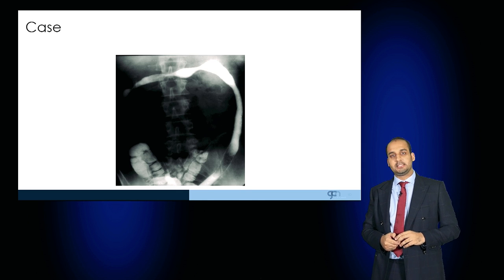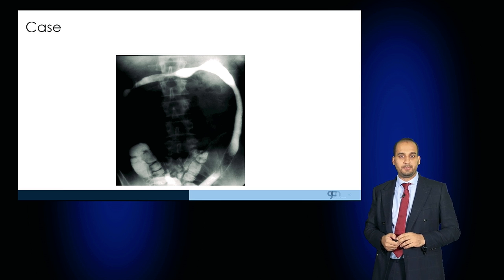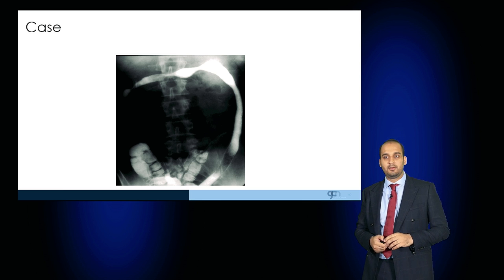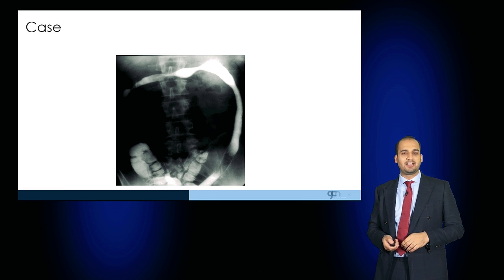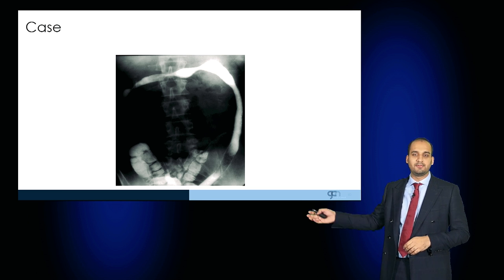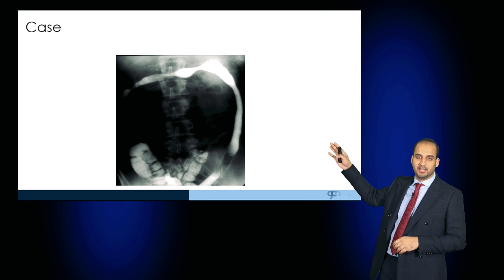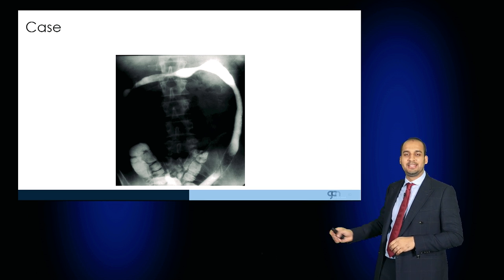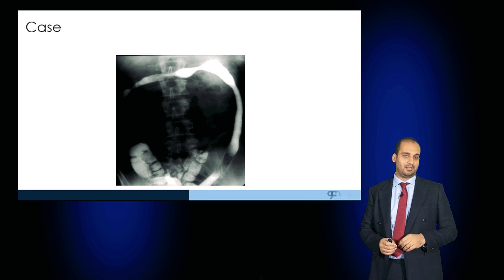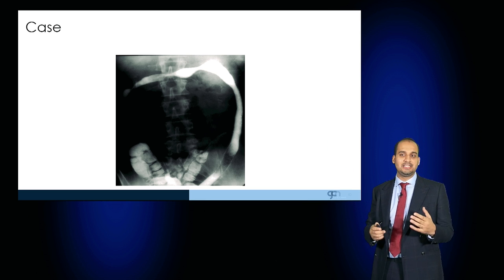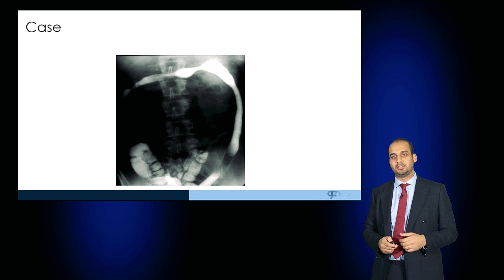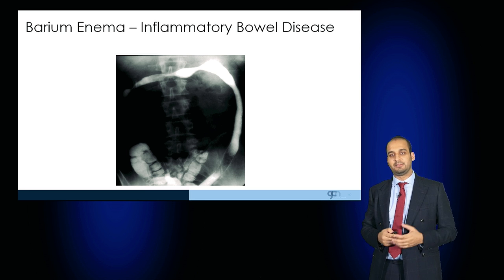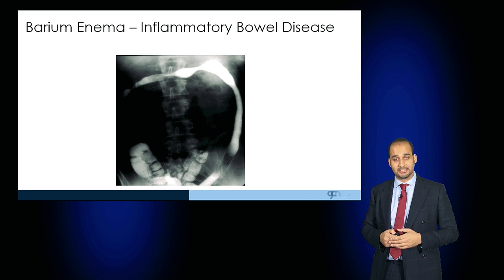Have a look at this — this is a barium enema given to a patient. What you can see is a complete loss of architecture along the transverse colon and the descending colon. And this is seen in conditions such as inflammatory bowel disease.